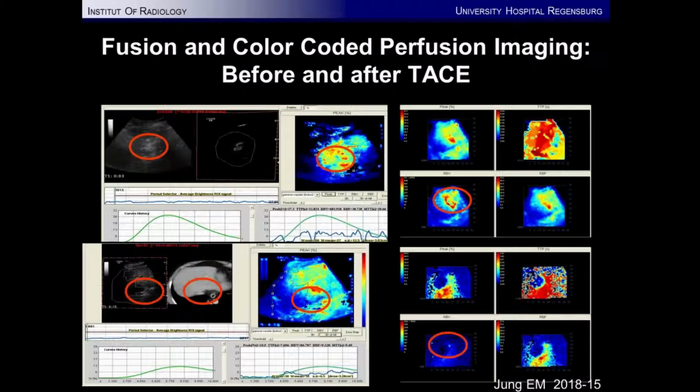The next step is, could we see it only using our eyes, or do we have a new technology for evaluation of success? Evaluation of success, look at this. In this case, in HCC-B4, in red and yellow colors, you could quantify the hypervascularization using perfusion imaging. And afterwards, if you perform an excellent devascularization, there is no red and yellow color in this perfusion quantification, you have an excellent result, color-coded as a blue one, complete devascularization.